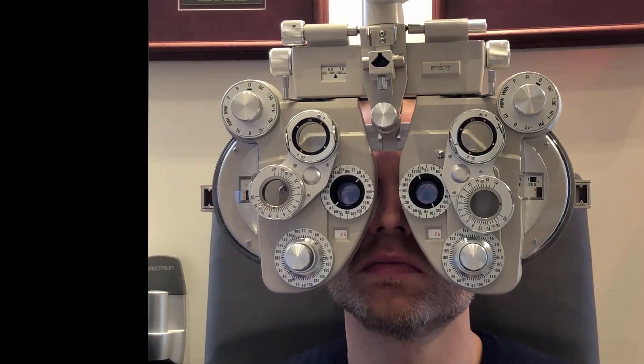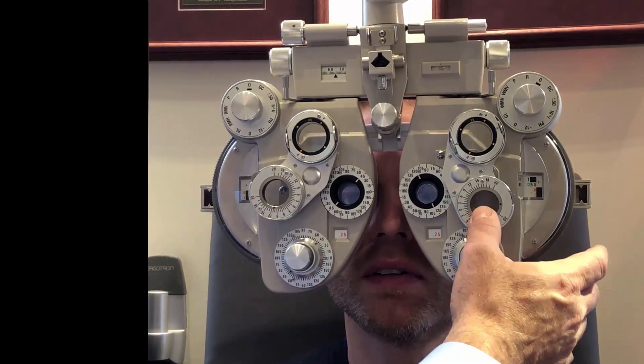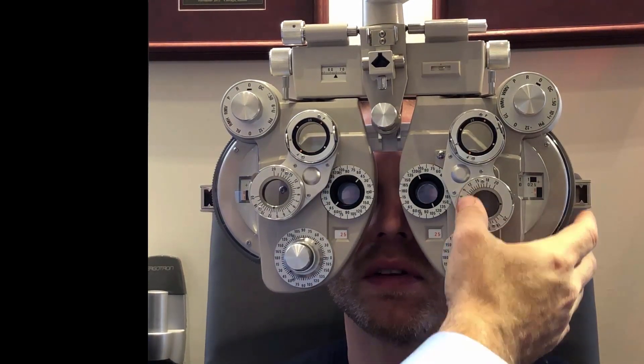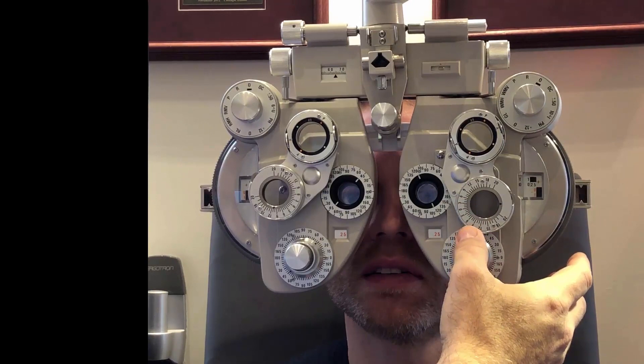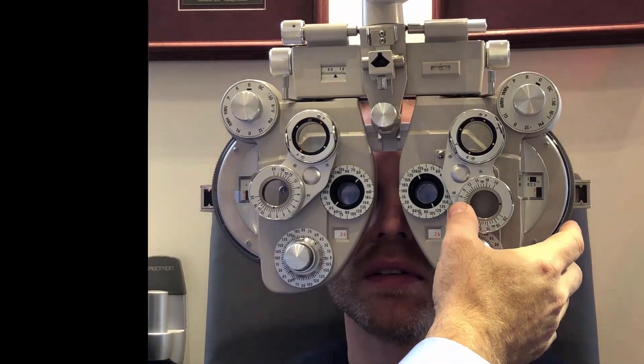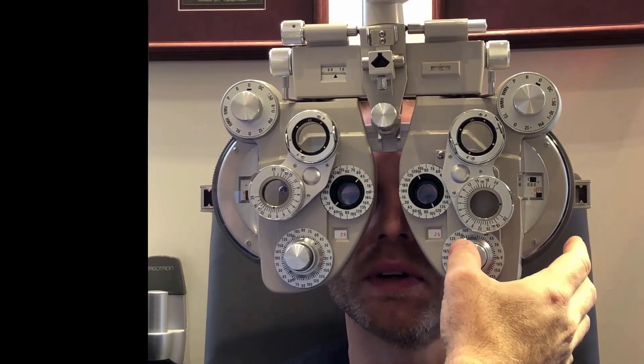When you're looking at the larger letters at the top, do they look nice and clear or do they look strange? A little bit strange. In what way? There's a little bit of ghosting. Look at that ghosting at the top there. Is it any different if I do that? That's a little better, yes. Is it gone? Not quite. What if I do that? That's better still, but there's a little bit still.